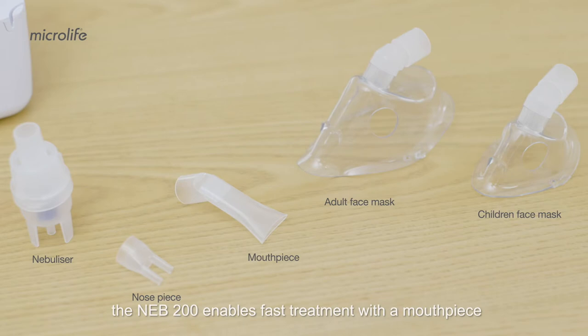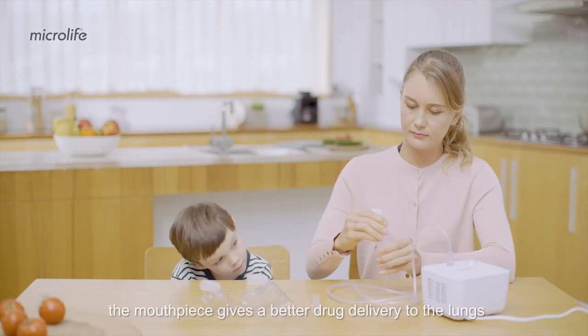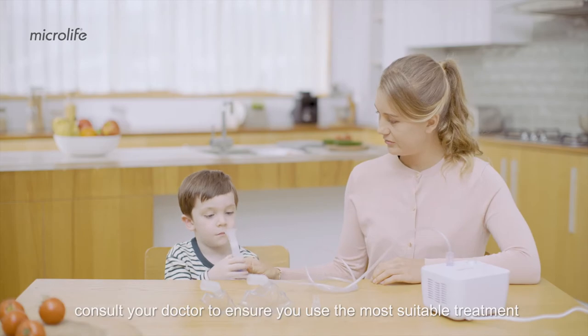The NEB 200 enables fast treatment with a mouthpiece, mask or nose piece. The mouthpiece gives a better drug delivery to the lungs. Consult your doctor to ensure you use the most suitable treatment.